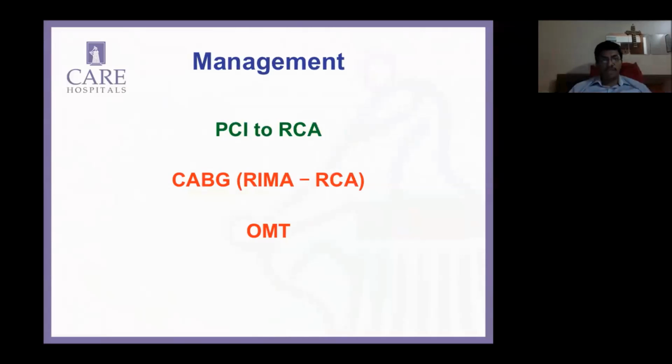Just to generate interest, would you do a bypass? Well, we didn't. And you don't want to keep him on optimal medical therapy because you have an occlusion there. It's short. The patient didn't have many symptoms, but he had ECG and echo evidence of a recent MI, and he's got risk factors. So we went ahead and did the PCI.